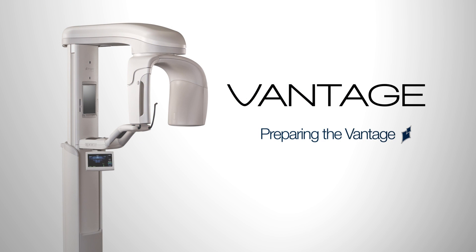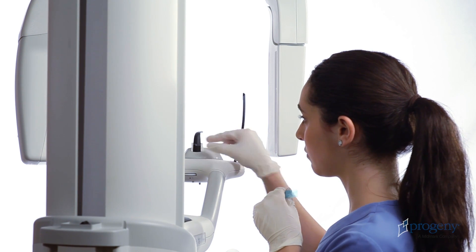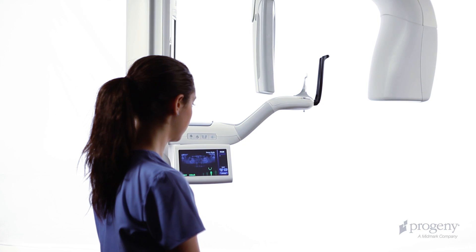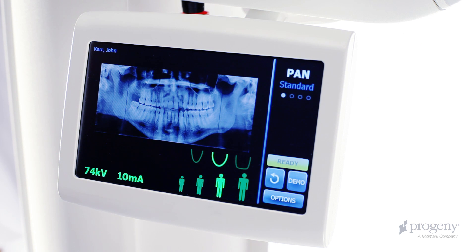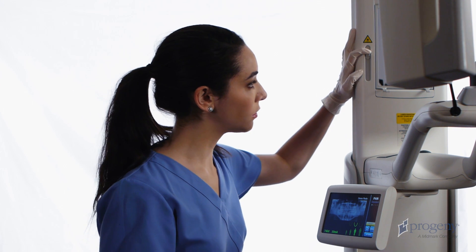Before introducing a patient for examination, we must prepare the system. If necessary, tap the cycle key on the Vantage Touch to bring the overhead to the patient entry position. Then verify the yellow ready indicator and place the Frankfurt plane laser in the lowest position.